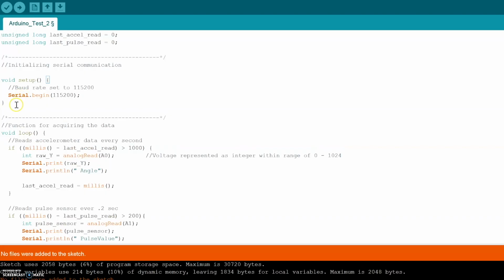The Arduino Nano sends information to the computer using serial communication. This is configured in the highlighted code. Here, we set the data rate in bits per second. This is called the baud rate of serial transmission.